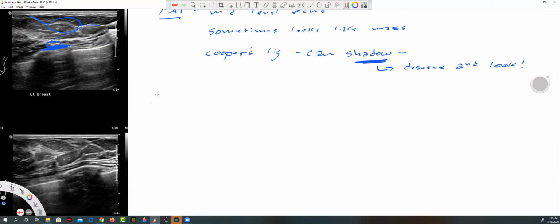Let's see, the mammary, I'll just write that. Mammary, it's hard to write all those M's in a row. Fibrous tissue, okay, so yeah, I mentioned this. The fibrous part of that is echogenic.